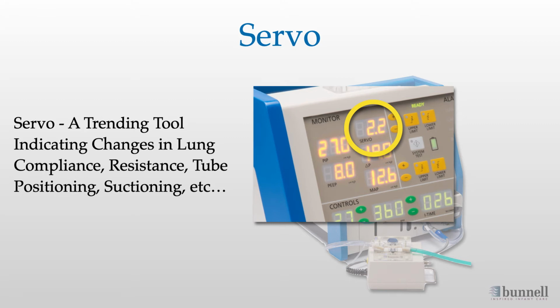For continuous alarms related to either servo or mean airway pressure, contact the respiratory care team for further evaluation, adjustments, and troubleshooting.